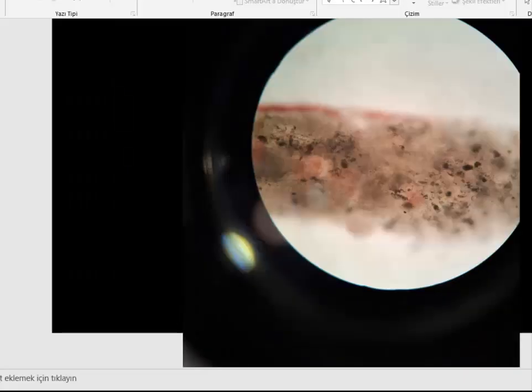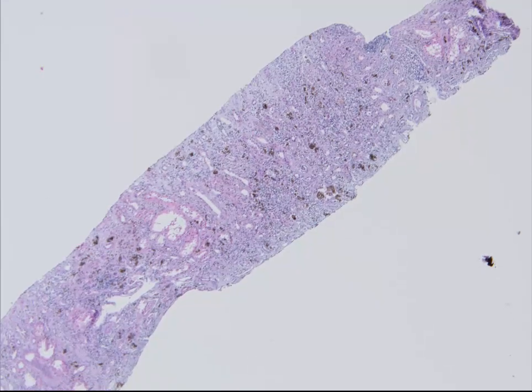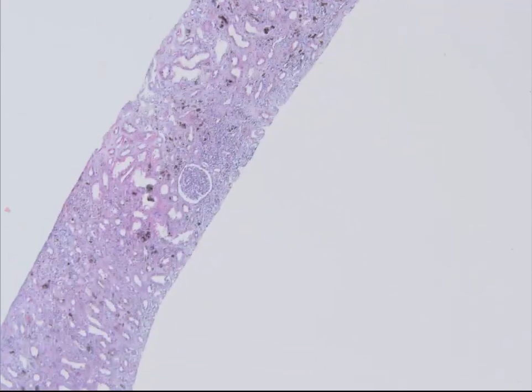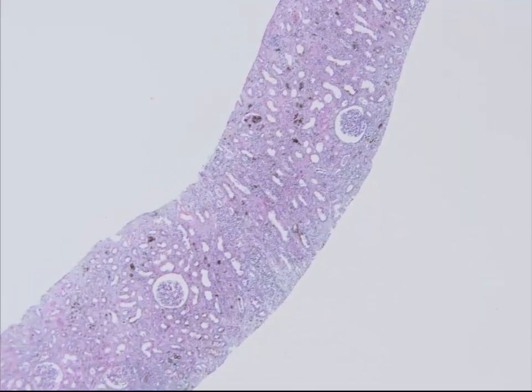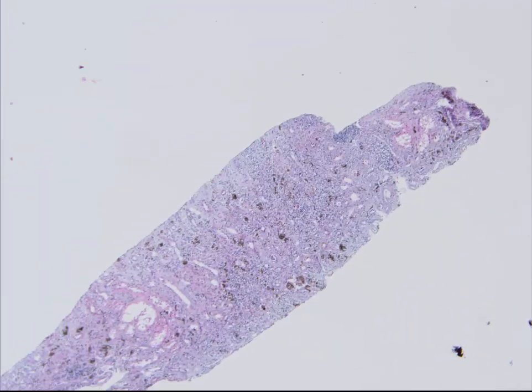The next day, we examined the histological sections. Here again, even under the microscope, you can see these areas of what looks for now like black pigments all throughout the biopsy core. I'm going to zoom in in a minute, so let me just quickly switch back.